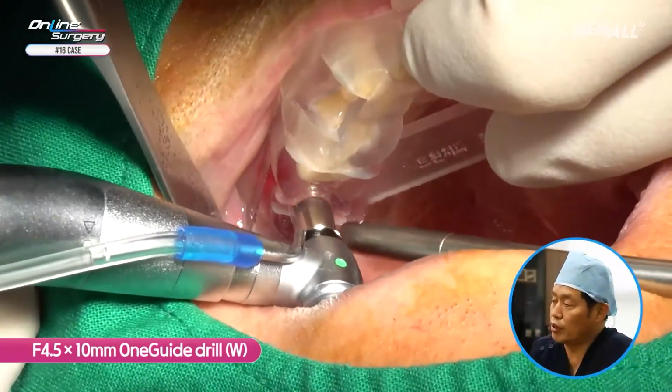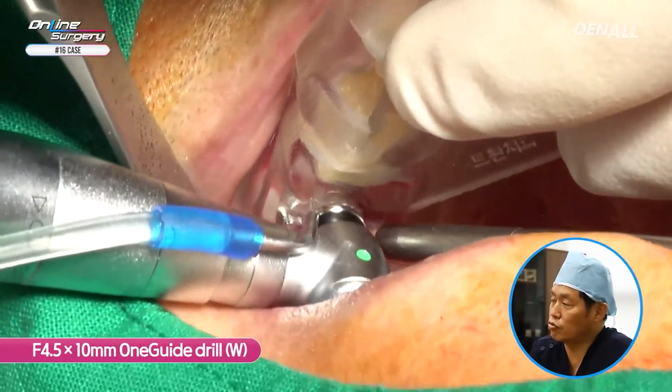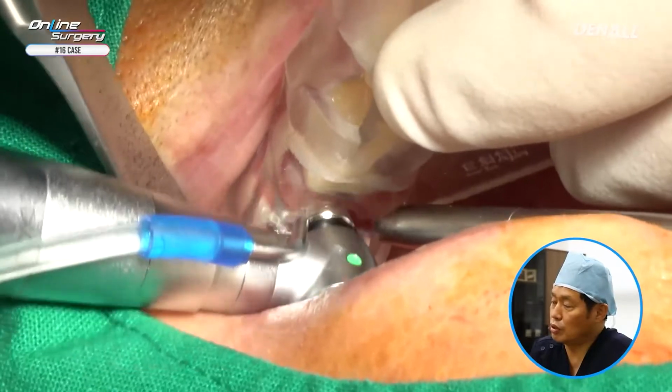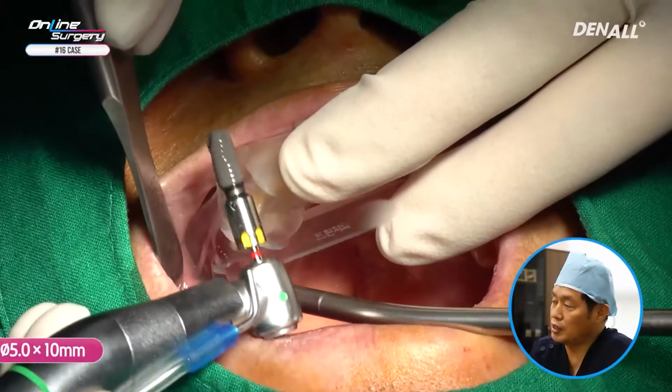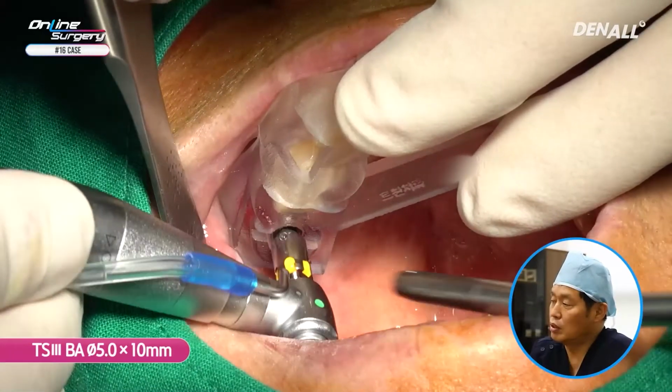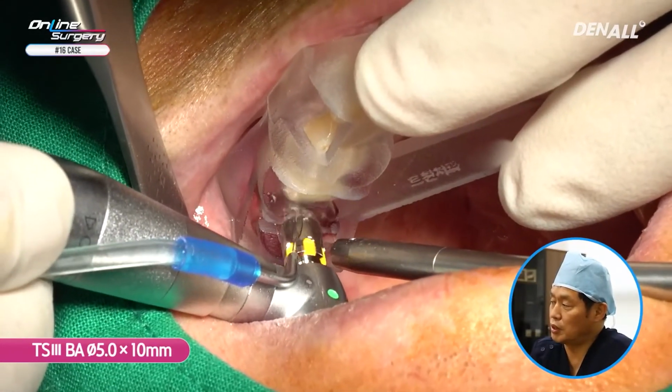4.5 by 10 millimeter drilling is done. Bone quality is not very good. TS3 5.0 by 10 millimeter is going to be done, and the final drill is going to be done up to 4.5. Fixture installation is going to be done.